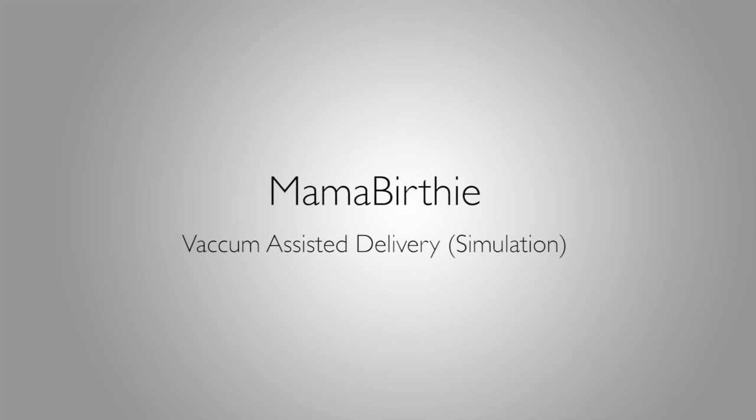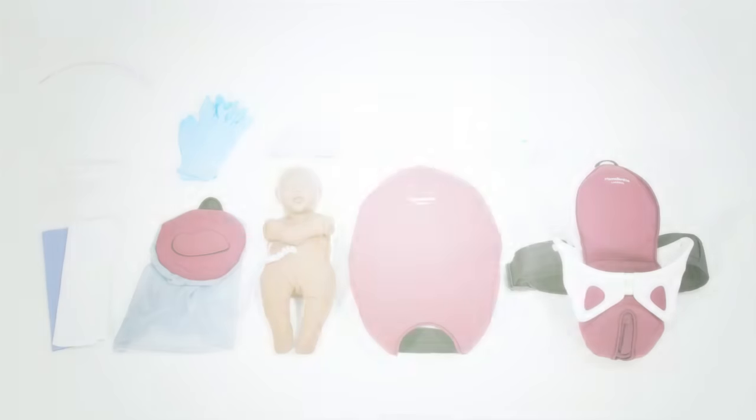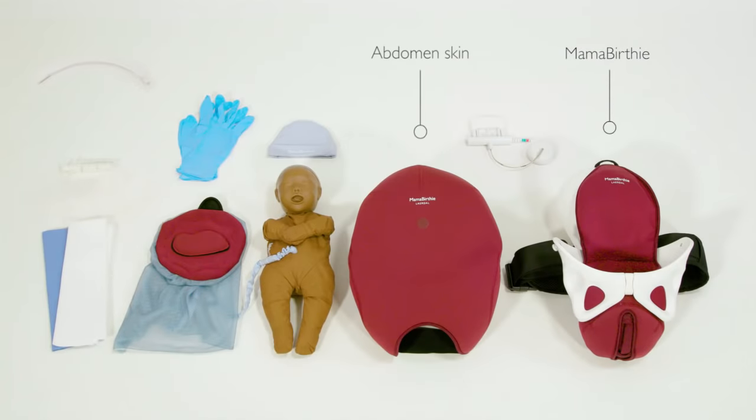This is an instructional video showing how to use MamaBirthie to perform a vacuum assisted delivery simulation. For this simulation you will need MamaBirthie with abdomen skin, baby Birthie, and the placenta.